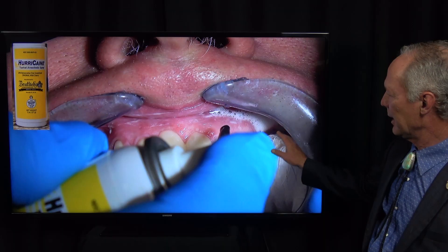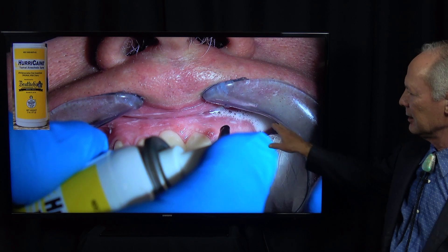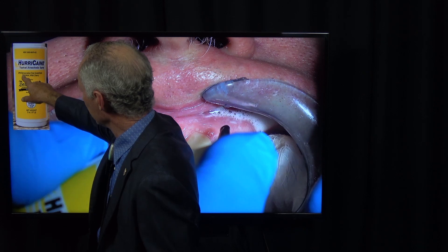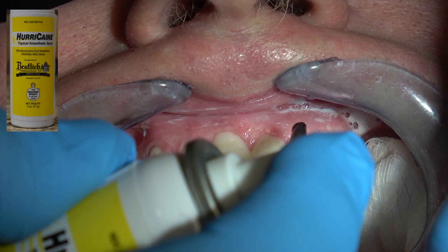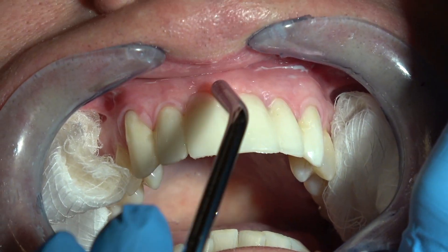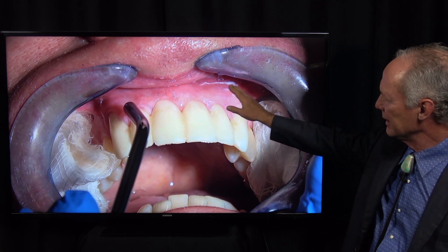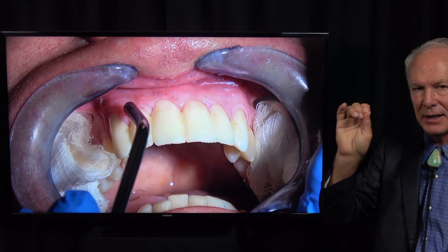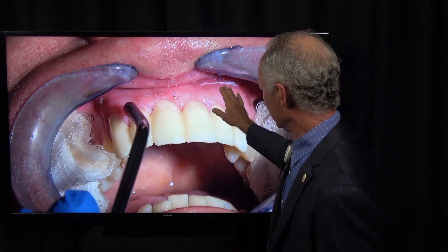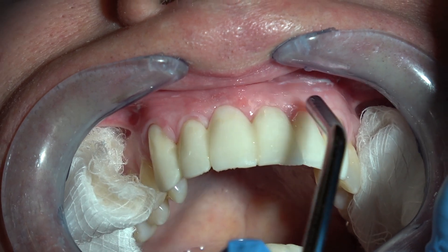Then I'm going to come back and spray. I've got two-by-twos behind the area that I'm anesthetizing. I'm going to spray this Hurricane topical anesthetic spray — it's 20% benzocaine oral anesthetic — in that area. Then, very importantly, blow it in with your air syringe. Blow it into the tissue. You just need a tiny bit of penetration — the topical and then the benzocaine hurricane spray, blown into the tissue.